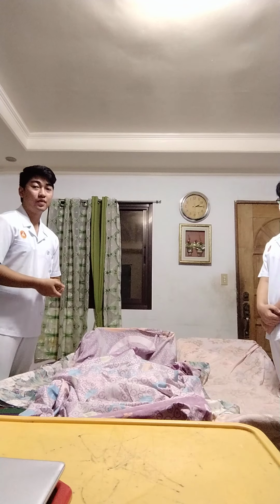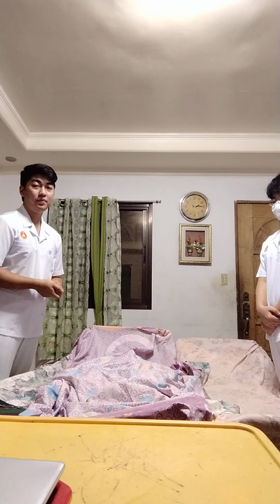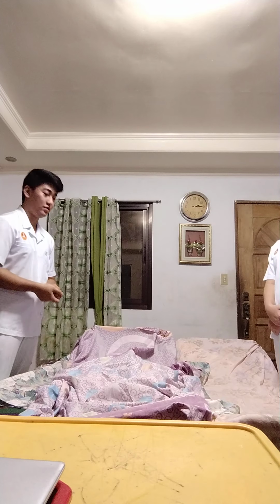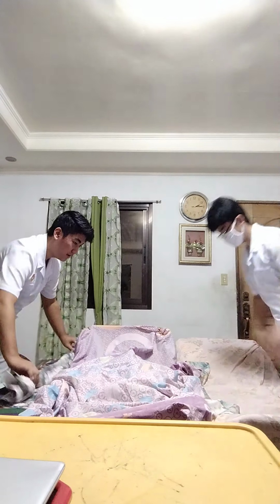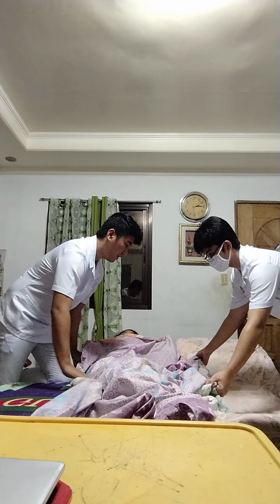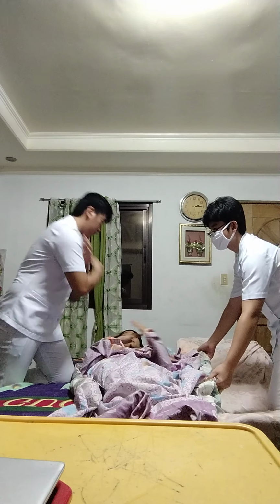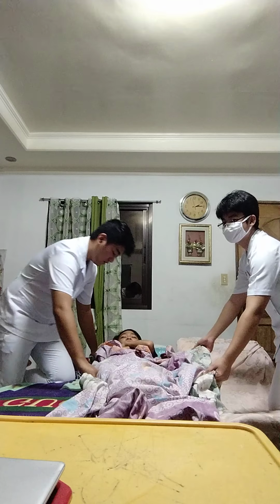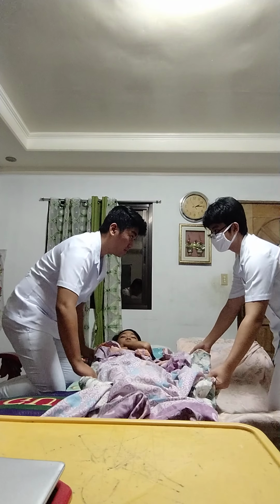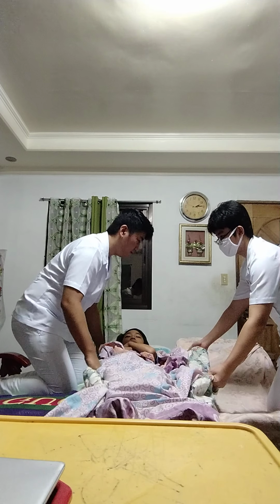At the same time, the nurse or nurses on the other side push, transferring the patient's weight towards the transfer board and moving the patient from the bed to the stretcher. One, two, three, go.